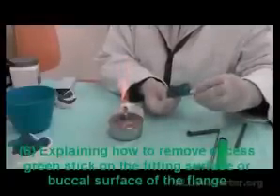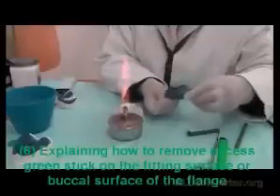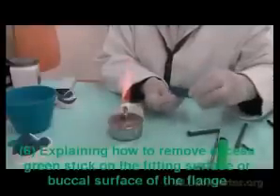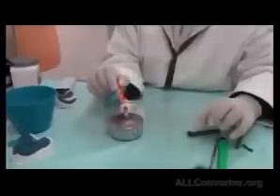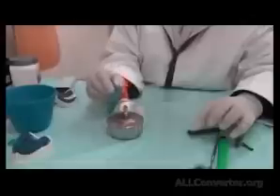Anything that is not attached or not sticky, I just remove it. I don't leave it because I don't want my material to be fractured later on. And a bit irregular, ready to be placed in the patient's mouth. I do the final shine, make sure it melts down a bit and becomes shiny. I cool it down in warm water.